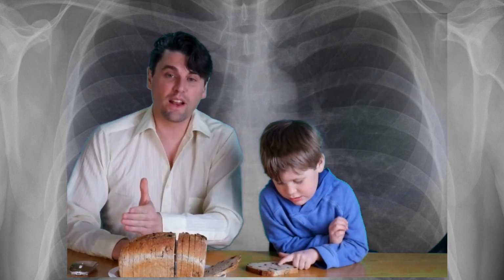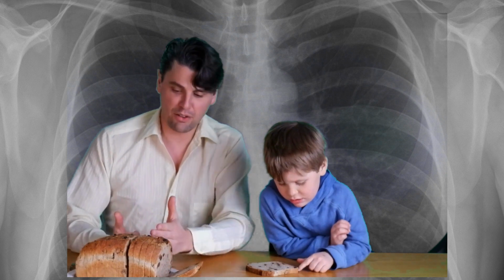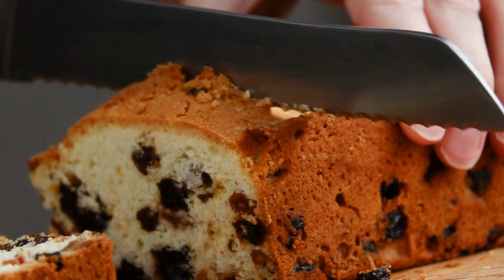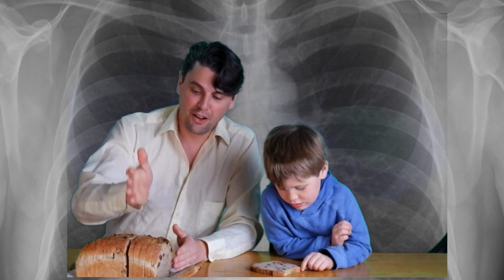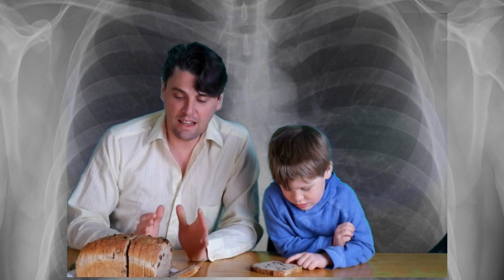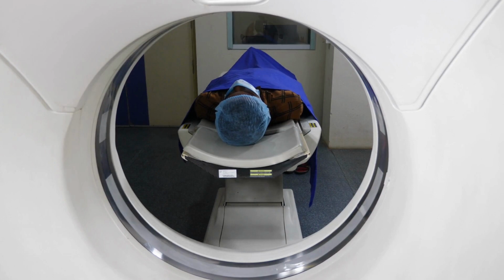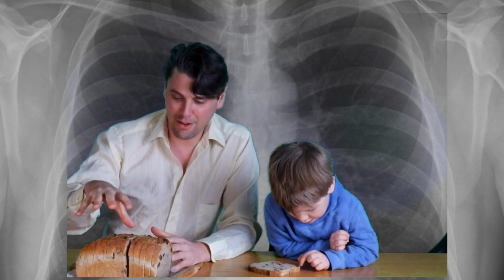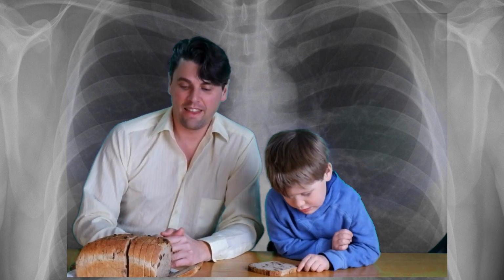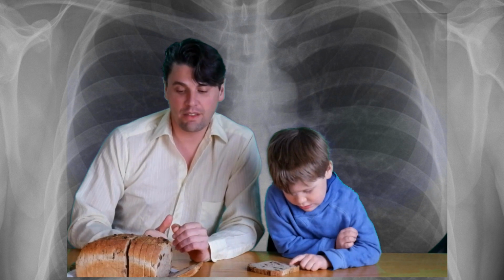We would have to go through and count the raisins in each of the slices, and also we'd have to make sure that we don't double count, because some of the raisins actually are getting sliced in half when the bread gets sliced up. So the idea is that we would like an easier way to do it. So that's where CT scanning comes in, where we can actually use our X-ray vision per se to look inside of this bread. And the idea though in a CT scanner, it's the same kind of thing.